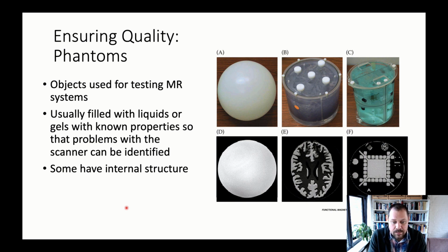Good, so I'll stop here for now. So we know something about the data structure now that we're working with. We know that we acquire 2D data sets, which become 3D for anatomical images, and 4D because the time component is added to this for functional images.